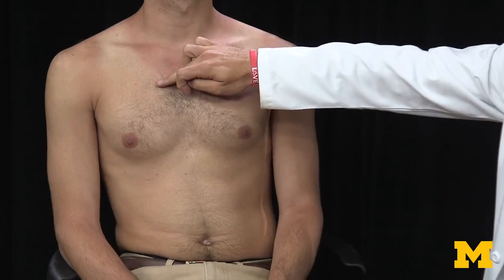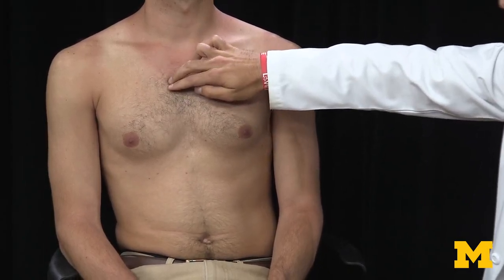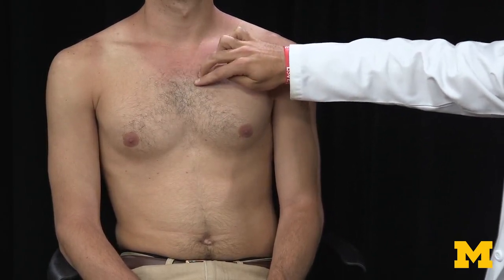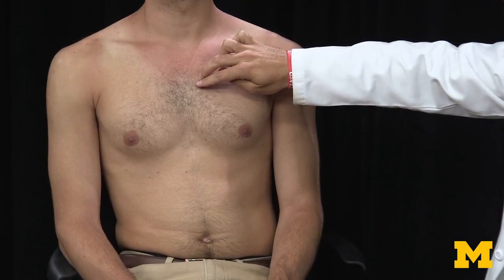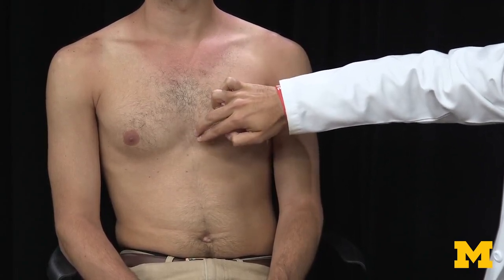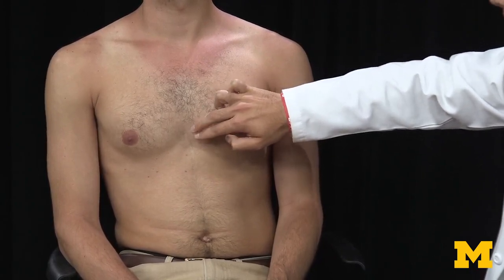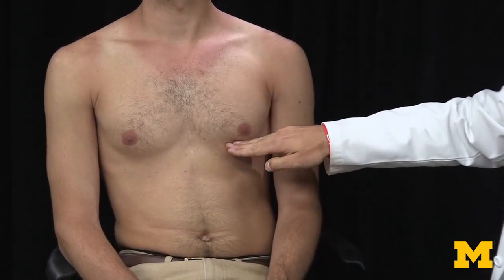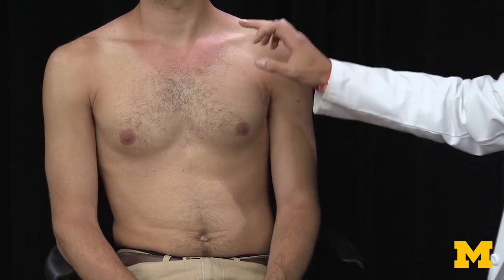To review, Apartment M: the Aortic valve at the second intercostal space on the right sternal border; the Pulmonary valve at the second intercostal space on the left sternal border; the Tricuspid valve at the fourth or fifth intercostal space on the left sternal border; and the Mitral valve at the fifth intercostal space on the midclavicular line.